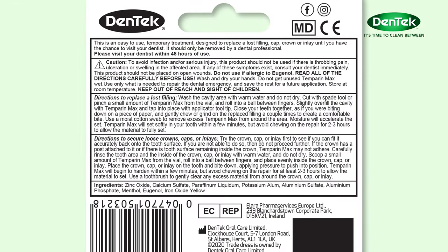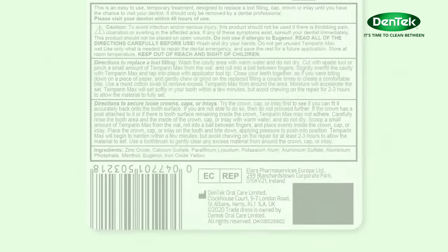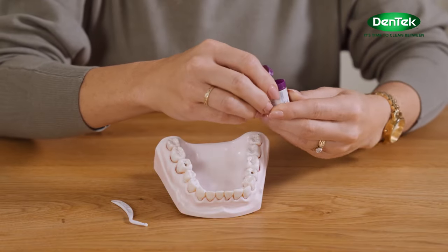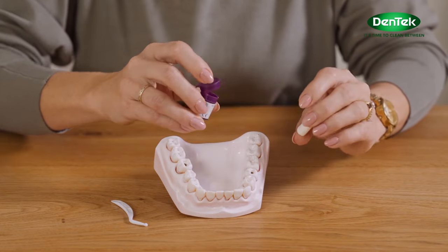All the instructions are here on the back, so don't throw it away just yet. You'll find a little purple pot and a plastic applicator stick over here. Now open the pot and you'll find a little block of a rubbery substance. This is the cement we're going to use to fill your cavity or fix your crown.